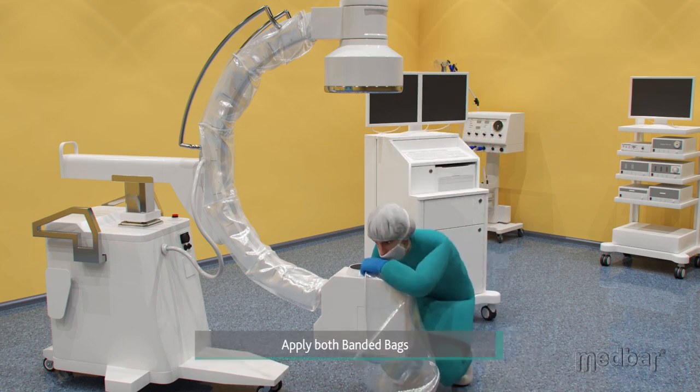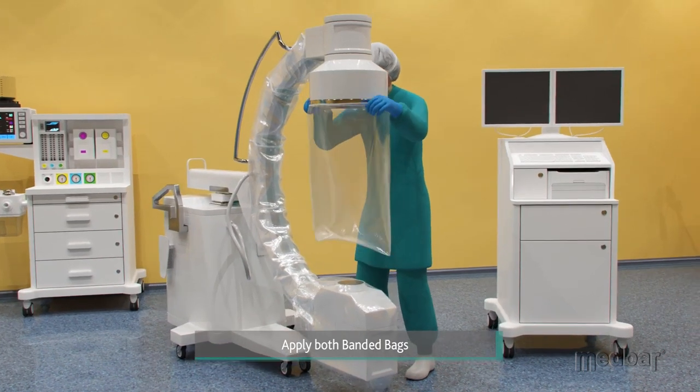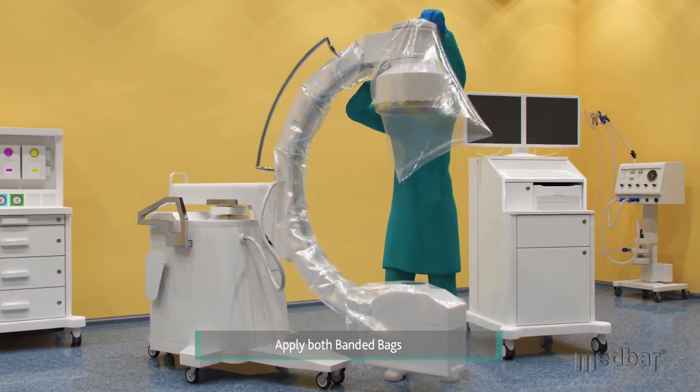Then, they will apply the fluoroscopy drapes to the machine. These are easily stretched and secured around each head by the elastic banding.